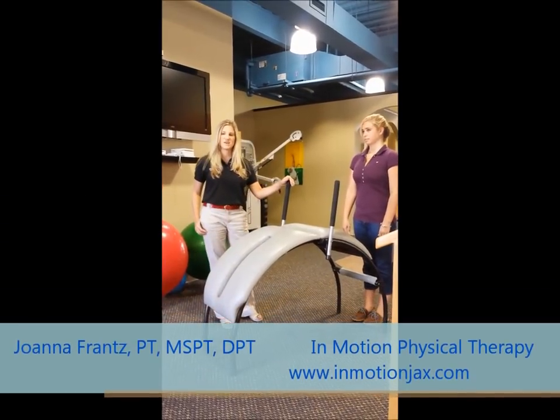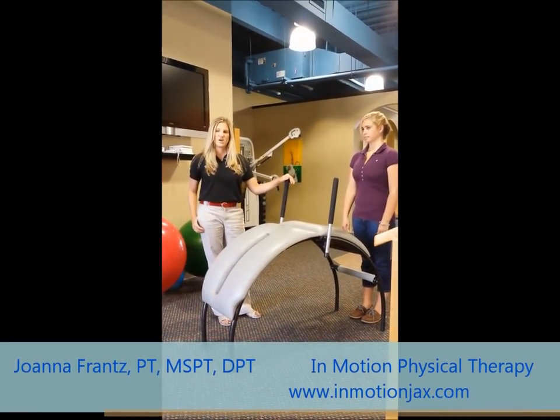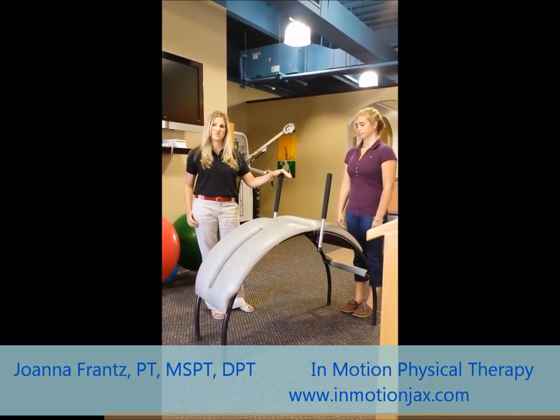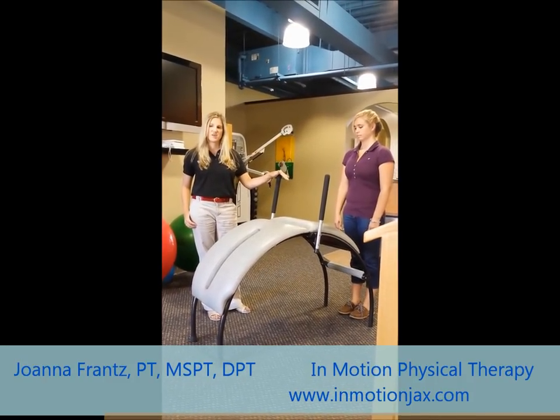Hi, I'm Joanna Frantz at In Motion Physical Therapy, and we're going to show you how we use this piece of equipment, which is called a body bridge. It's a great way to stretch out your back and your neck.